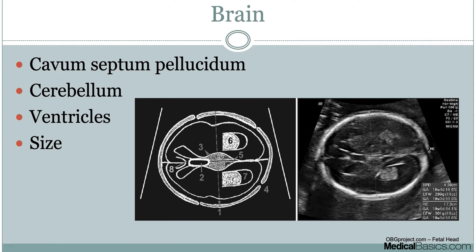The goal is to determine if there's something majorly wrong with any of the major brain structures. They'll look at it in various projections, because certain findings — for example, with the cerebellum, whether it's large or small — are better seen on specific views such as a sagittal image.